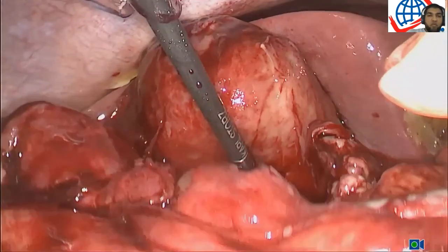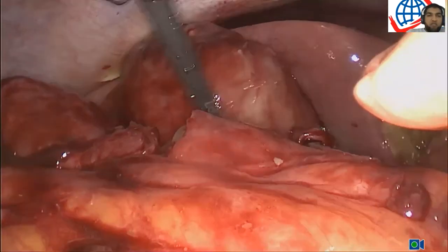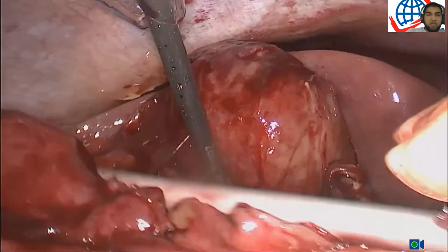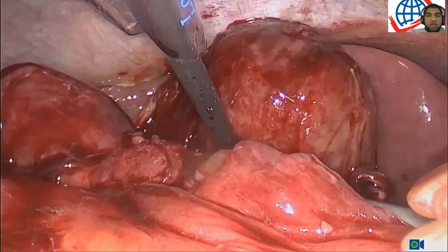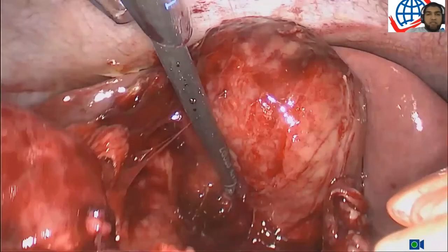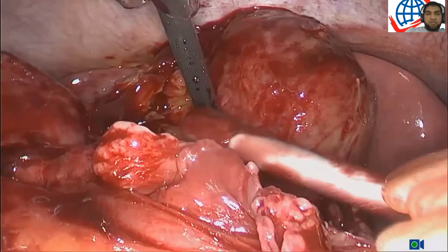Without completely mobilizing the gallbladder, it is extremely difficult, almost impossible, to then go and find the cystic duct and the cystic artery and dissect Calot's triangle. So this part of the operation is extremely important to make place for yourself, separate the gallbladder, and it gives you the best chance of being able to dissect the important areas.